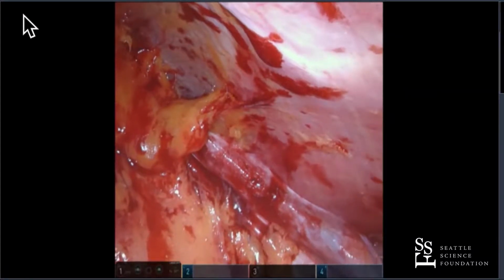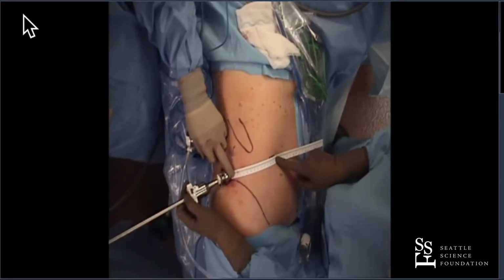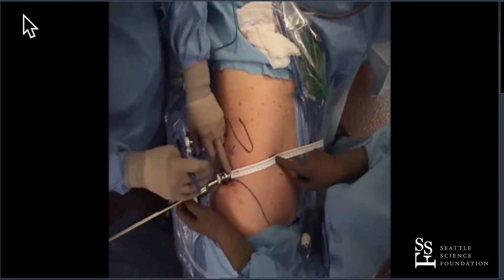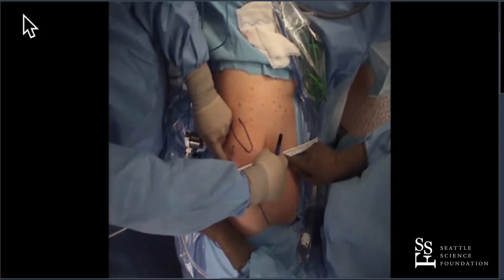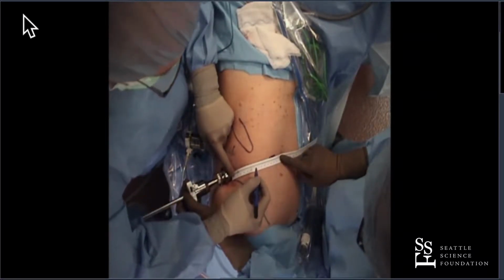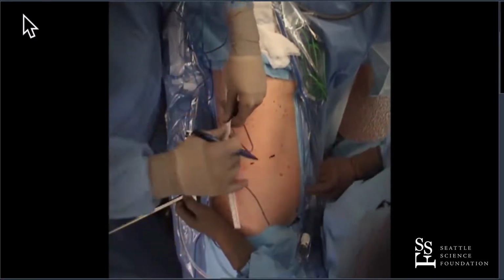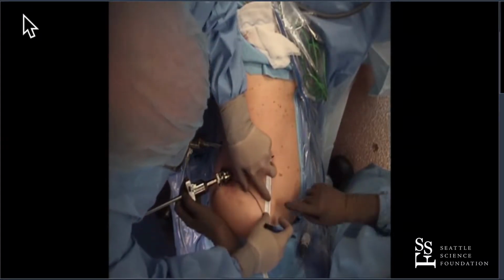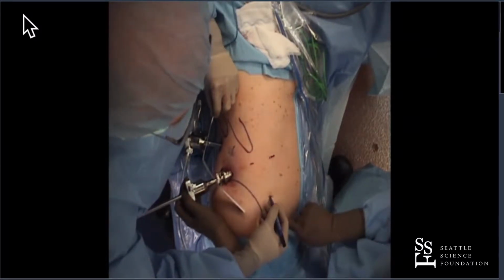Let's go external view. All right, so on the outside, I'm measuring from the camera to where we did a little push here, and you can see where that is on the outside, so we've got plenty of space there. I'm going to make our farthest anterior incision about 13 centimeters, and then my right hand here, arm number 3, is going to be about 6.5 centimeters, so I'm just making a mark there. One of the important distances is between the most anterior arm and the assistant. So we're going to go about 8.5 here. And then I'm just going to push there. This is going to be 12.